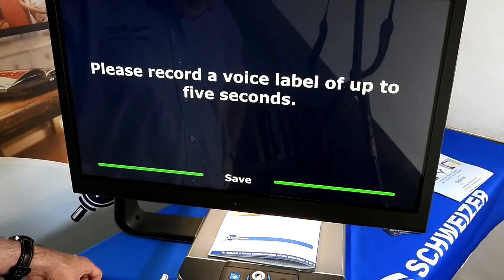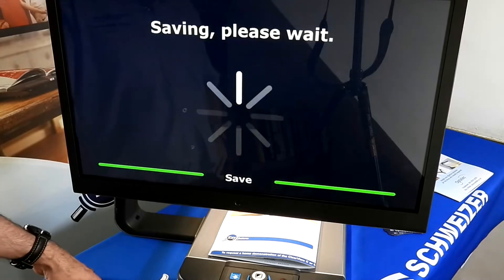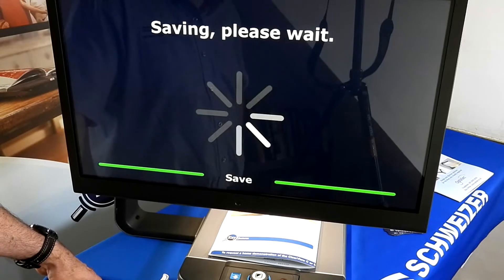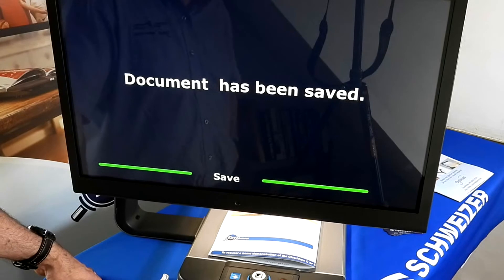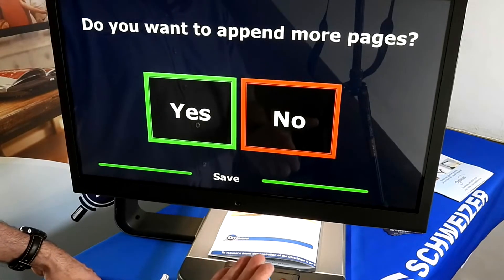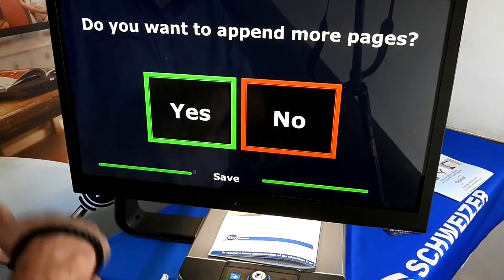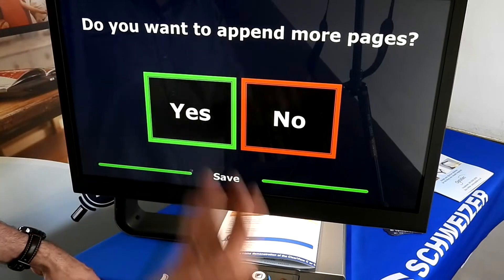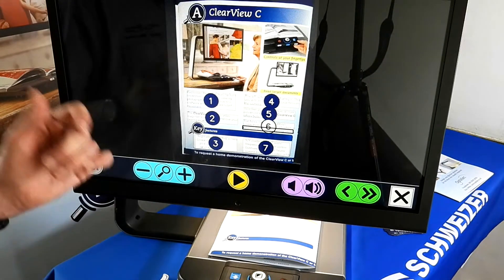The machine prompts: 'Please record a voice label of up to five seconds.' After recording, it says 'Saving, please wait' and then confirms the document has been saved. It then asks 'Do you want to append more pages?' If you have multiple pages to scan in one go, you click Yes, scan the next page, record a voice label if you wish, and it will ask again whether to append more pages. Once finished, you click No and it processes everything.